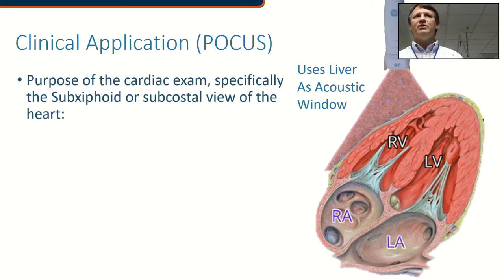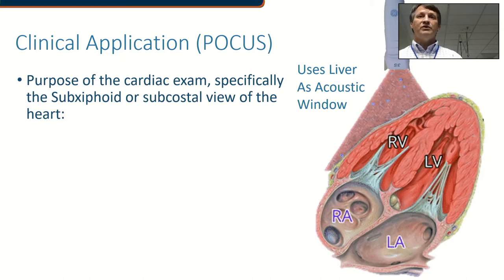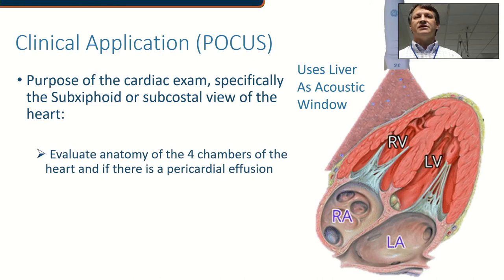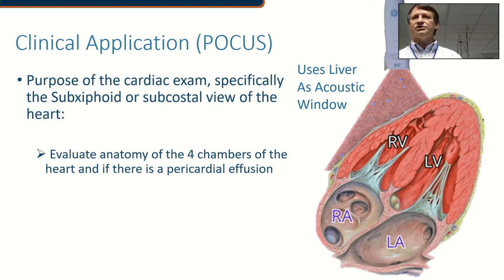You may want to look at the function of the four chambers, the function of the valves, or the squeeze. You can even see the aortic outflow or the pulmonary trunk outflow in these views with a slight adjustment, and you can see the connection to the lungs with the pulmonary veins. We want to evaluate the anatomy of the four chambers and see if there are any pericardial effusions.